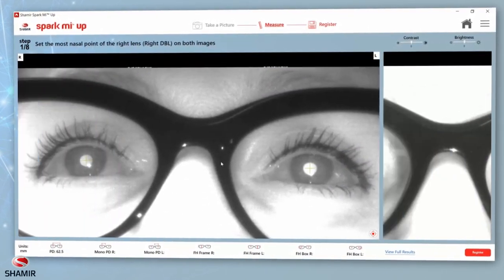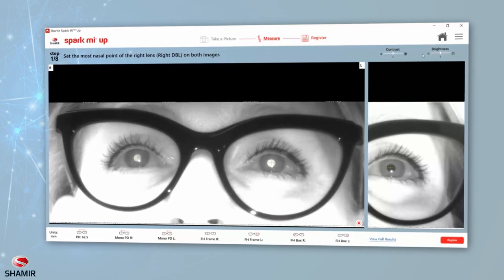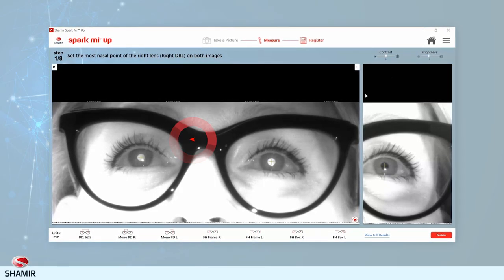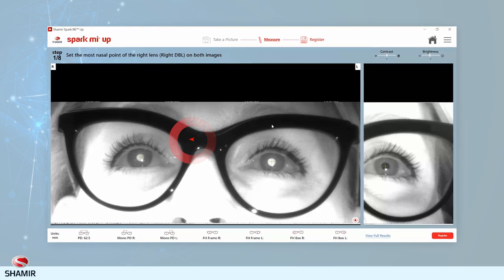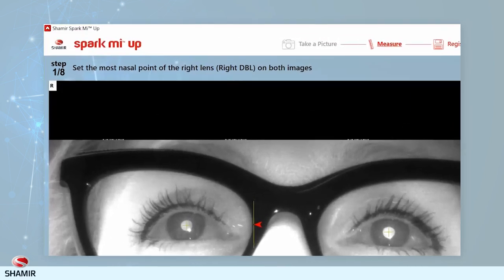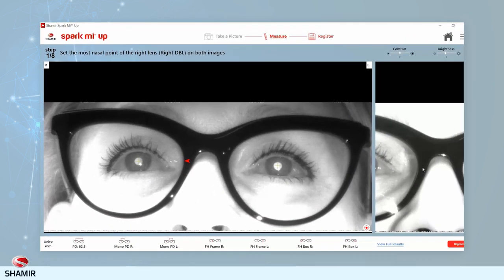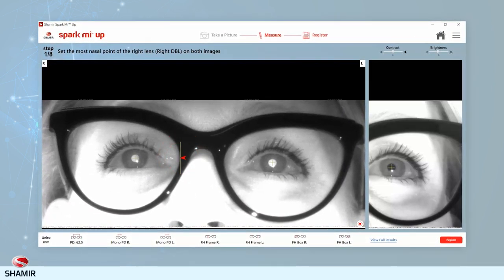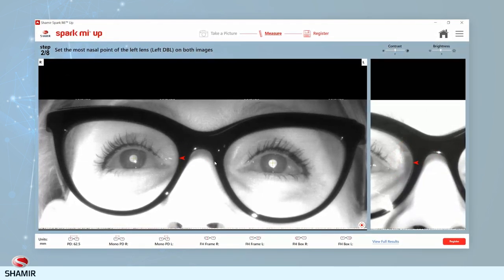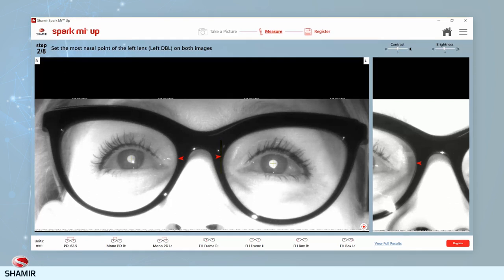Move the image by clicking and dragging it. To overcome image disturbances such as glints or dark areas, use the Contrast and Brightness slider. The current step that needs to be marked will be indicated by a red flashing arrow with a yellow line on the relevant image, together with an explanation of the measurement point displayed at the top of the screen. DBL right and left should be marked on the primary image and then adjusted on the secondary image. Click on and hold the red flashing arrow to drag it to the appropriate location so that the yellow line will be tangential to the lens.